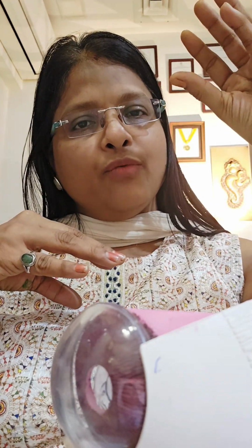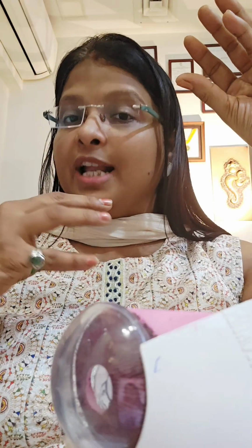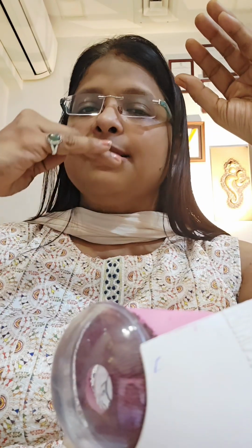The second of this type is a pure extended depth of focus lens, which is also known as EDOF lenses. These EDOF lenses again give you a very great monofocal distance vision like a monofocal lens, and near vision is not like a multifocal lens. It is in between monofocal and multifocal. It gives you a great monofocal vision for distance, but the near vision is slightly lesser than the multifocal lenses.